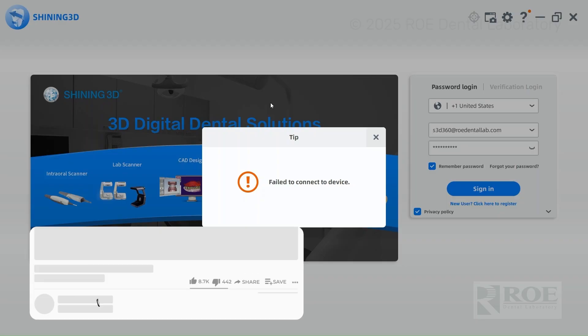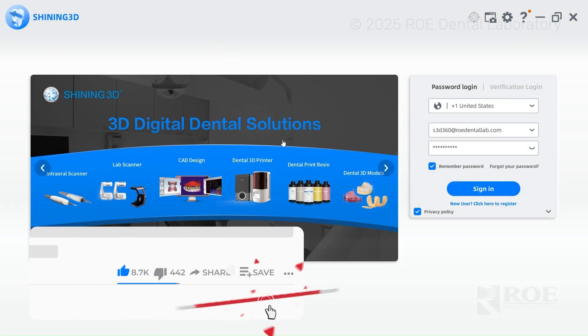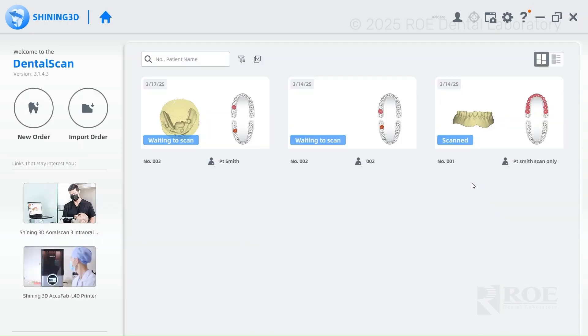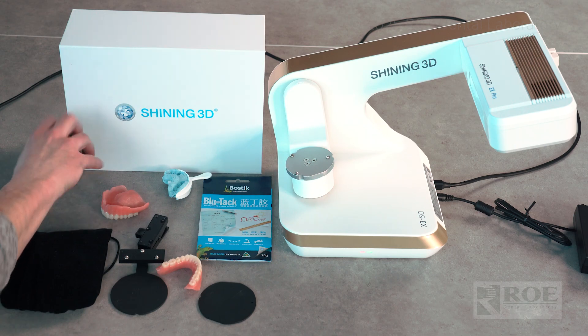Turn all your equipment on to start, then open up your program. Sign in — your password will usually be saved — and connect. After signing in, you're going to go to new order, but before you do that you want to get the elevating plate set up.